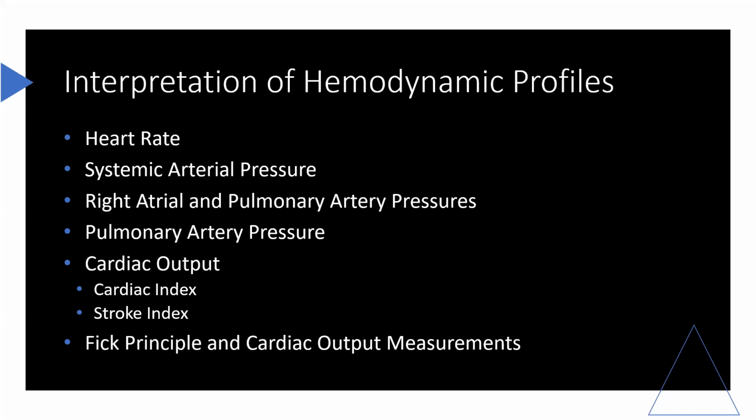The pulmonary artery pressure waveform resembles the systemic arterial waveform previously discussed. However, the PA systolic and diastolic pressures are considerably lower than the systemic pressures. As does the systemic arterial pressure tracing, the PA pressure tracing shows a rapid rise to peak pressure during systole, followed by a gradual tapering to the dicrotic notch.